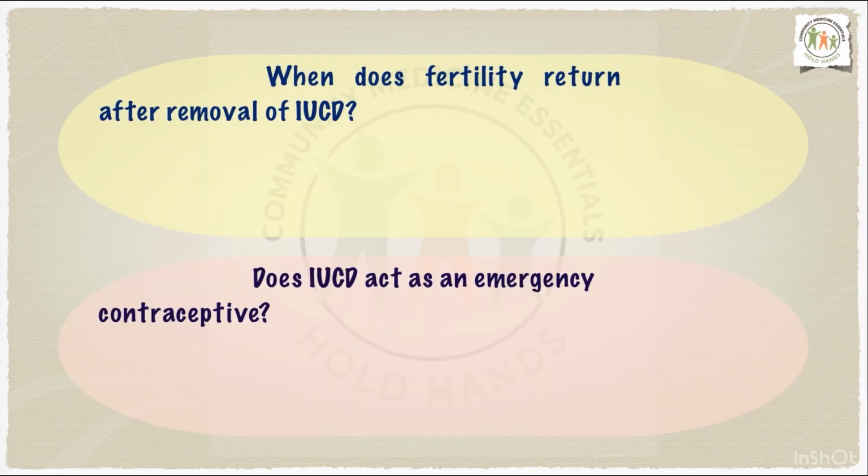Next question is, when does fertility return after removal of IUCD? It returns immediately after removal of IUCD. Then, does IUCD act as an emergency contraceptive?